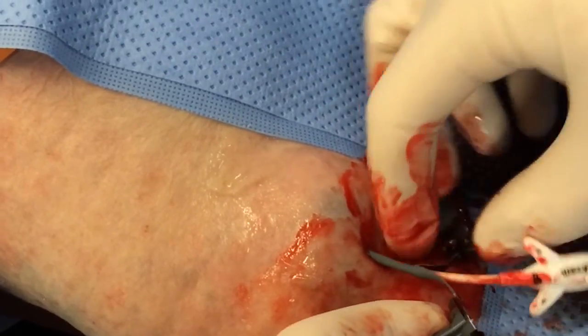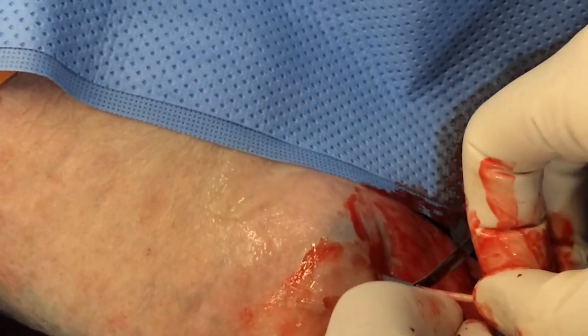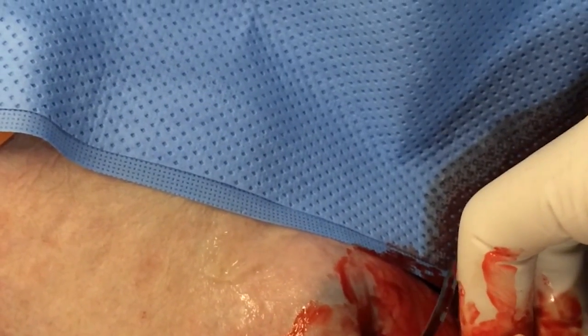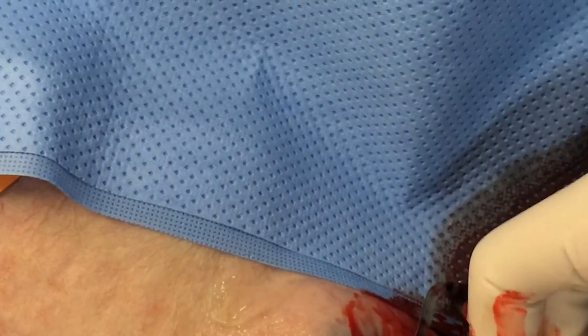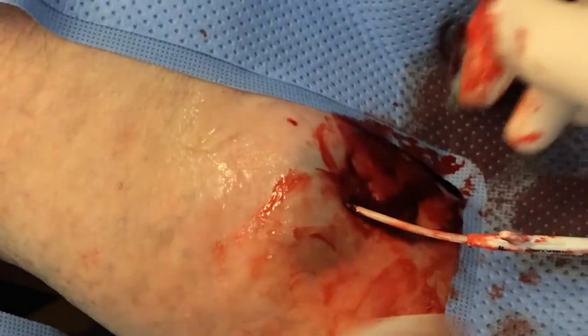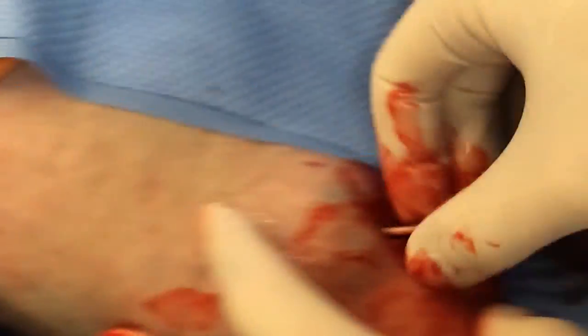You keep pulling it out over the midline itself. Pull it out, break. Pull it out, and break. And we lost the last little pull, but you'll see it in a sec. There it is. Okay, final break is done. Now you could hub the midline.